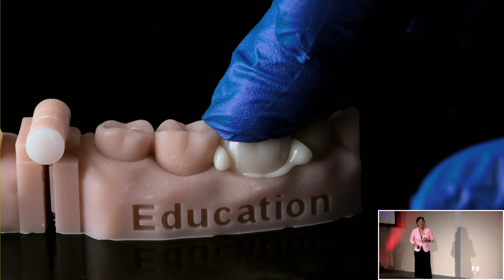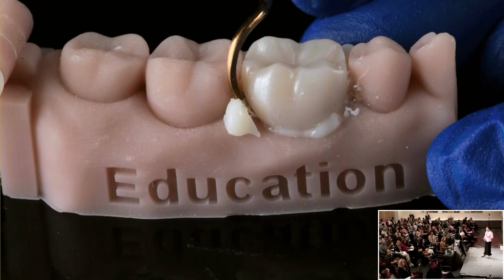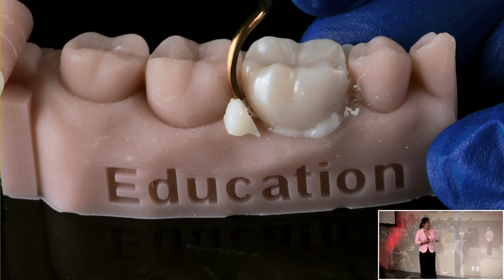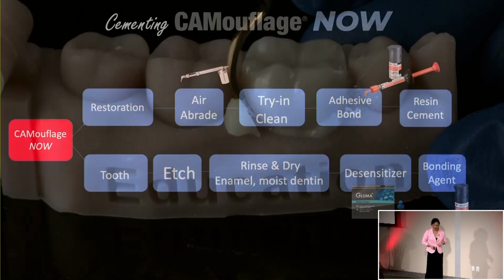This is the part that nobody likes. I don't like it. That's why a lot of us don't like to bond our restorations. So tack cure, split second, just check it, and then go in there and start removing before it really starts to set. A lot of these dual cure cements take about a full 6 minutes to completely set, but you're working against time. If you don't like working against time, there are other cements available. You can use a light cure only cement. There are companies that make that, but you want to be careful.